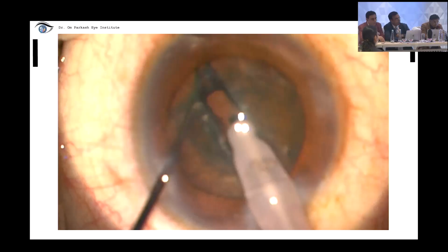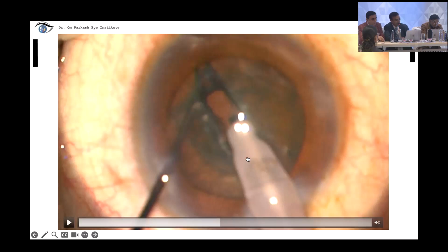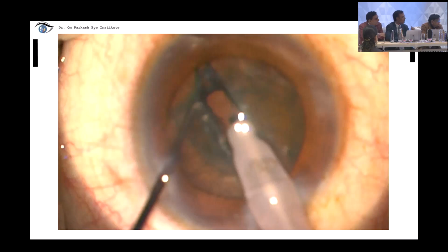Most often you can get away with it if you don't have fluctuations in the chamber and make enough space for you to be able to see what's happening and replenish viscoelastic, push some high quality, dispersive viscoelastic, which will stay over there and plug that gap. And you may be able to complete the surgery as well, but be prepared. And of course, an IOL scaffold, if you had a smaller piece, you could have brought it out of the bag and put an IOL scaffold. Absolutely. Rohit, 1 minute. Yeah, absolutely.